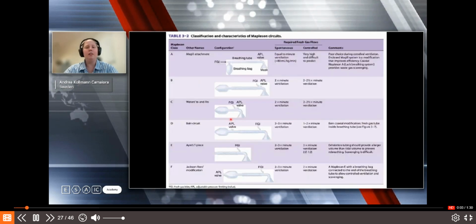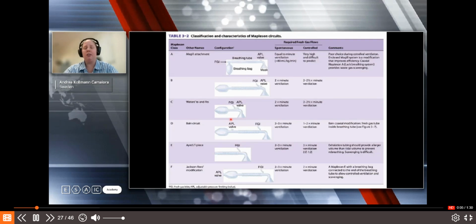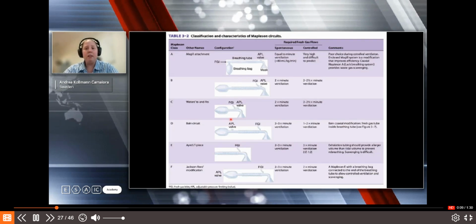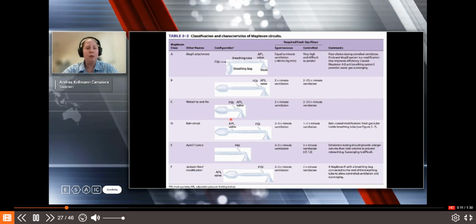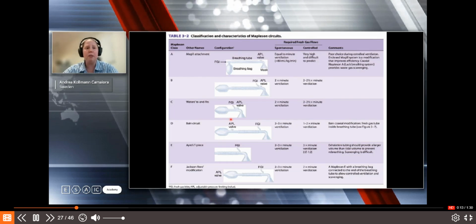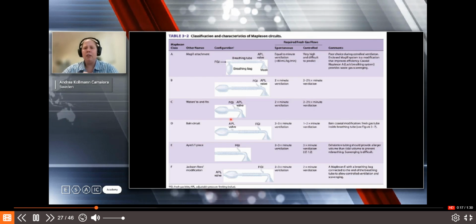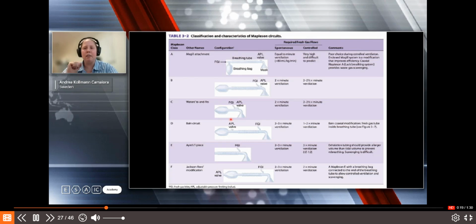This I won't explain in detail because this is memorizing. You need to know them for the exam. Because in the exam, both in part 1 and part 2, there are a lot of questions about breathing systems, and they can ask you. For example, in part 2, a typical question is, choose 2 breathing systems and describe and compare them.